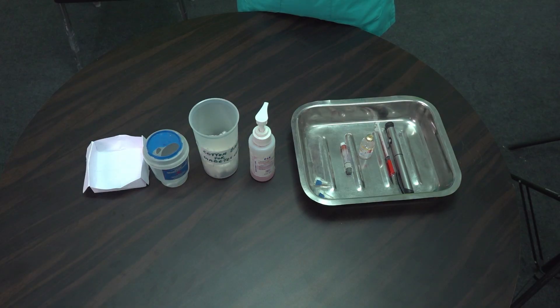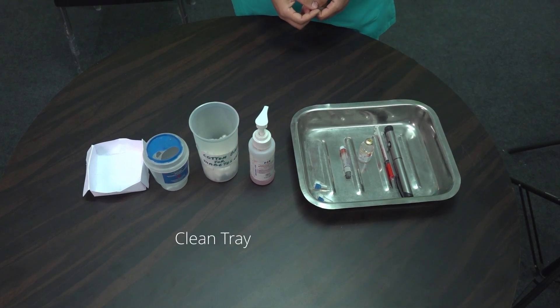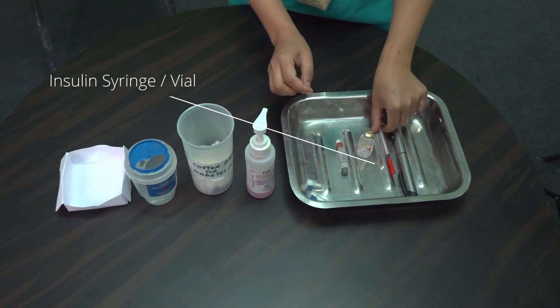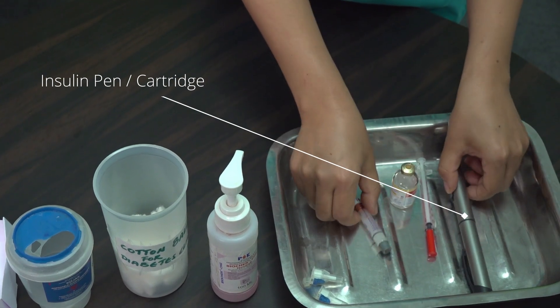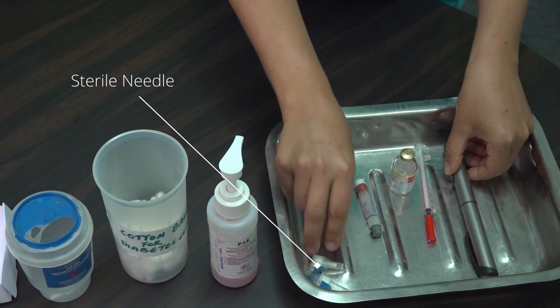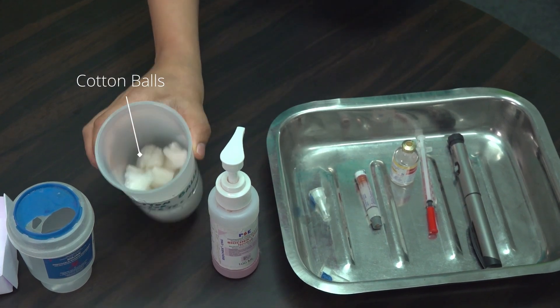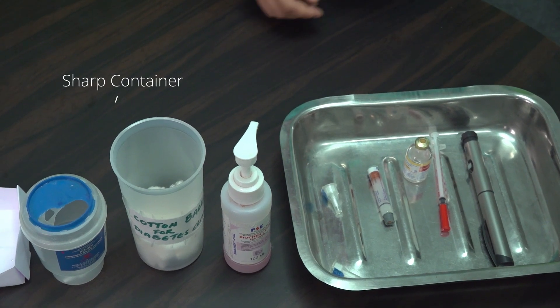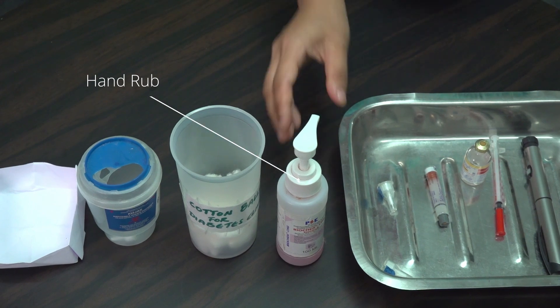Before we begin, let's review the essential articles required for insulin administration. On a clean tray we have an insulin syringe with vial, or an insulin pen cartridge and a sterile needle, clean cotton balls soaked in spirit for skin disinfection, a sharps container for proper disposal of needles, and hand rub for hand hygiene.